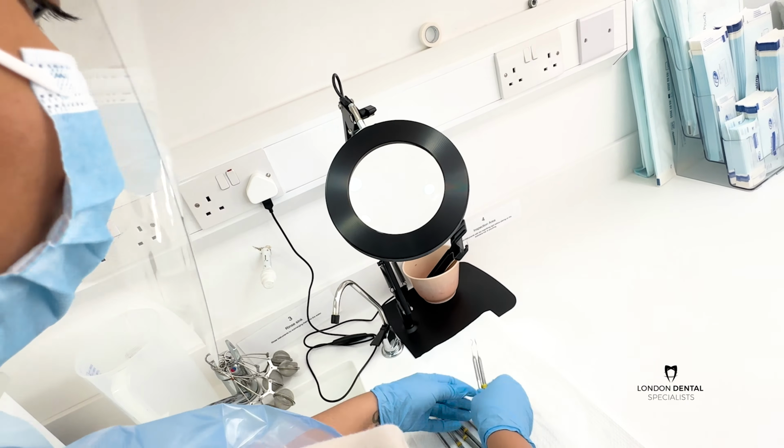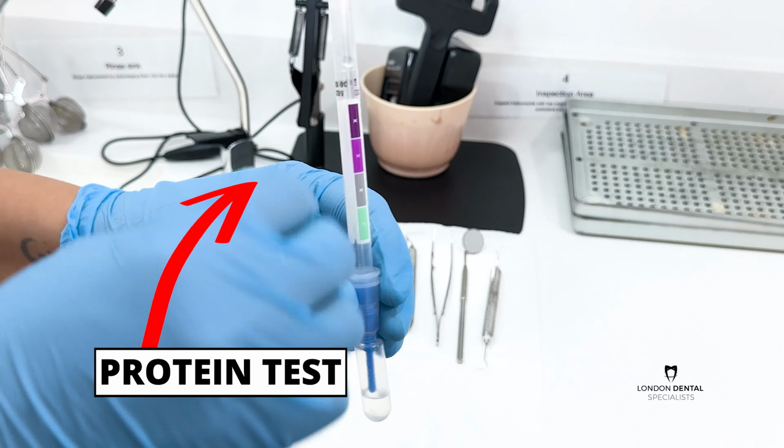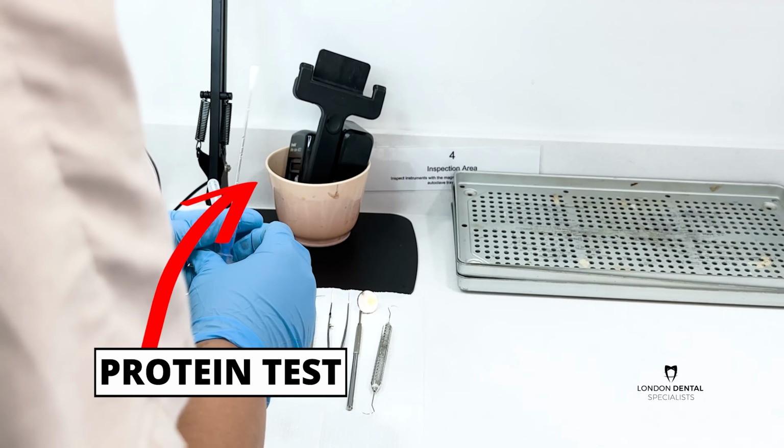We know that those instruments are free of visible debris from previous patients. But how do we know that they're free from proteins? And why am I talking about proteins? You will all remember mad cow disease from all those years ago, and the fact that it could be transmitted from person to person by proteins. And what we now do is check that those invisible proteins have been adequately removed by immersion in the ultrasonic bath. Ghislaine is going to do our protein test with this little kit right now.